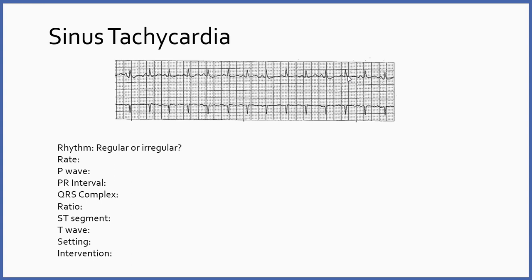And next we're going to find the ST segment. So remember, the ST segment is this little bit of time. Now I got some bumpy artifact here, so I'm going to ignore this. But it's this little bit of time after the QRS to the T wave. Well, where'd my T wave go there? Yeah, that's kind of ugly, huh? How about this one? QRS to T wave.